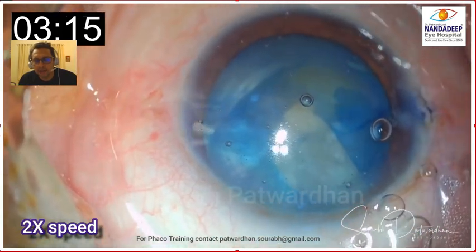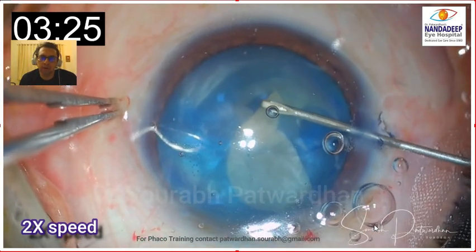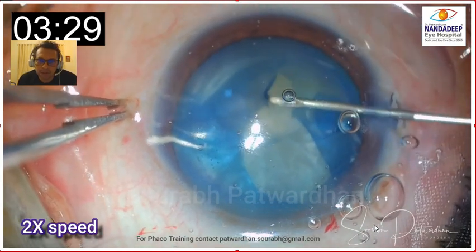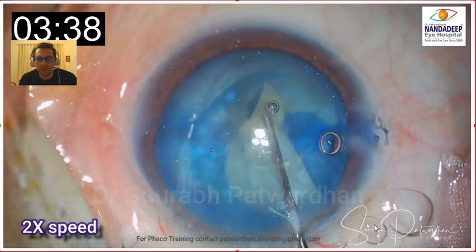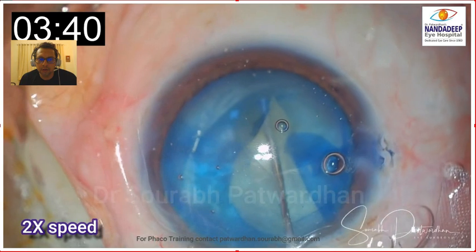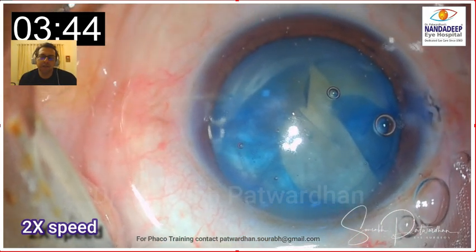This is a situation where you should use the left hand. The surgeon adds more viscoelastic, but you can see the axis is already gone. The surgeon has given up hope here, though I might have tried a quick pull technique. The surgeon still has not taken out the fluid from the lens, and now tries to do that, but of course it's already quite late. The surgeon is trying to take out the fluid from the main incision, which has multiple problems: visco is going to come out while the fluid is being aspirated, the AC is going to be even shallower, and we can expect this tear to extend. Also, this tear should have been made tangentially rather than radially.